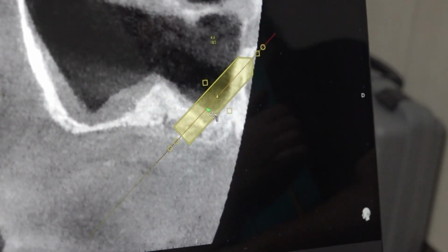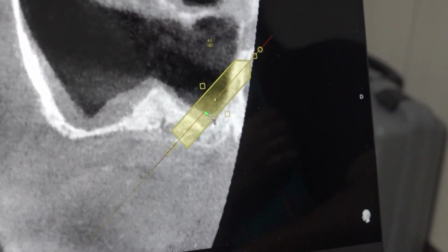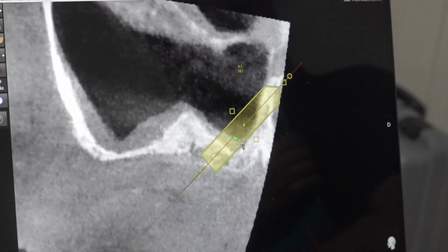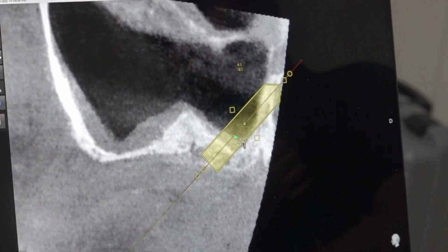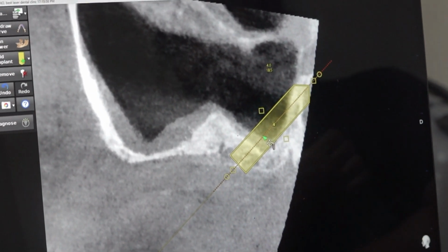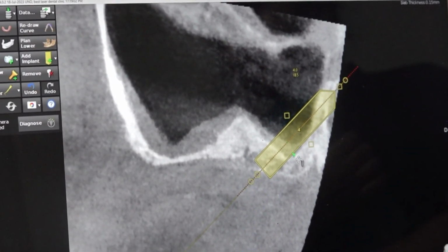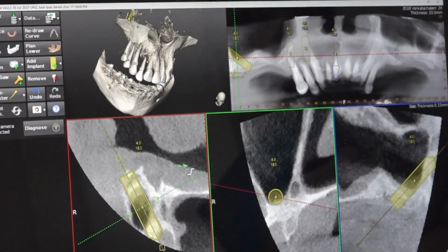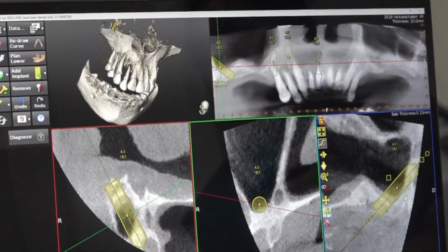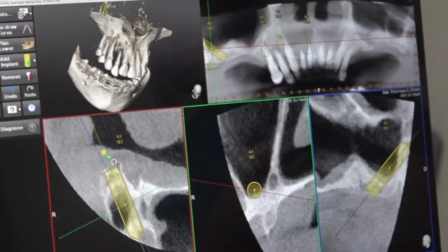blind procedure. If there is bone, it will guide our drills. Since there is no bone, our drill will be freely floating inside the sinus. Even if you perforate the pterygoid, your implant may find it difficult to perforate the pterygoid. So a transsinus pterygoid is always much more challenging than the regular pterygoid. Okay. Anyhow, it is a good pterygoid.